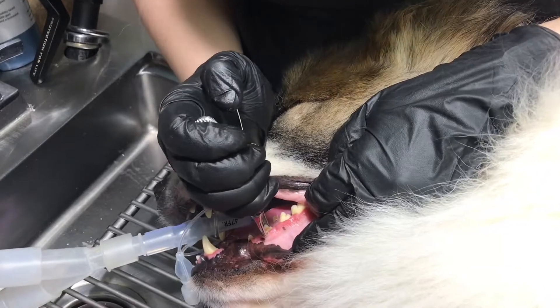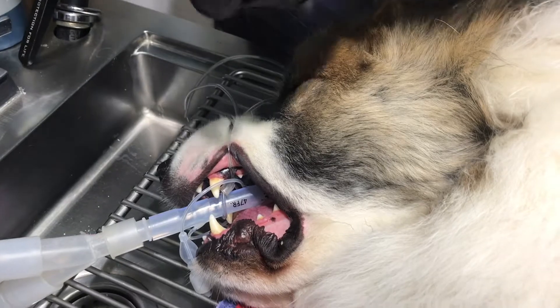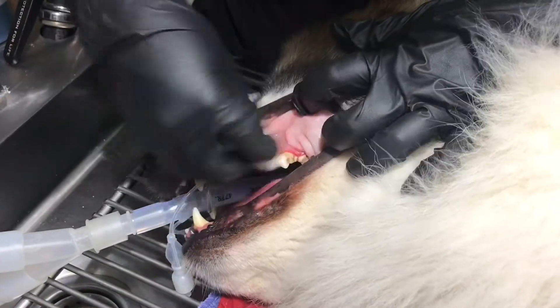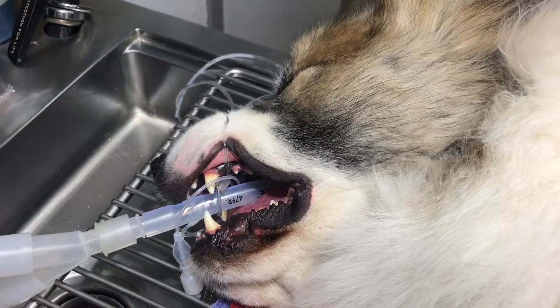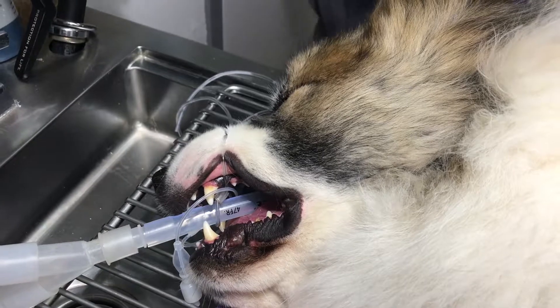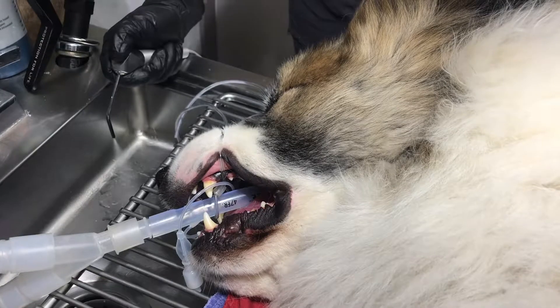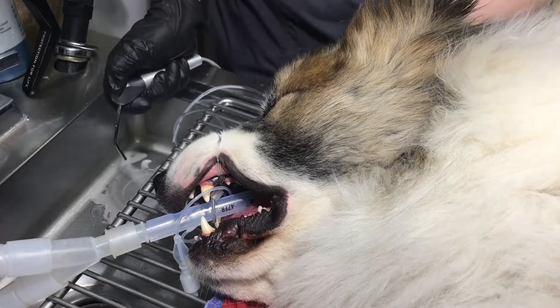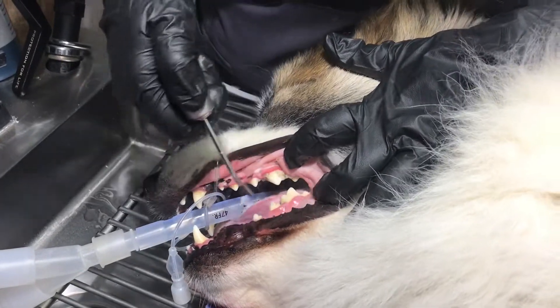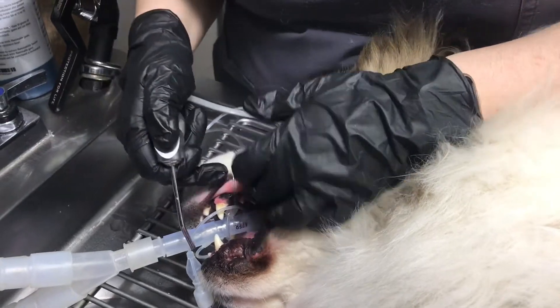Big chunks of stuff are coming off of there — that's very therapeutic if you're cleaning them. You'll probably notice that when she's cleaning, you're going to get a little bit of bleeding. That bleeding is caused by excess gingivitis, or inflammation of the gum tissue, and that's caused by the tartar that builds up. That's why we recommend annual dentals in all of our pets, particularly the smaller breed dogs. They develop tartar much more quickly than our big guys, but every dog needs it.